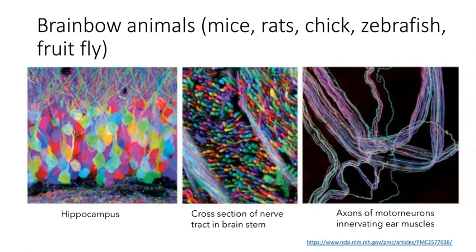The staining techniques I've shown you in this video have ranged from relatively simple to really quite complicated. There are many neuroscientists that go through their entire career and never look at tissue stained with anything more complex than a Nissl stain. But for other neuroscientists, those who are interested in studying the brain at the level of individual neurons and their interconnectedness, advances in cell and molecular biology have made possible experiments that Cajal and Nissl could only have dreamed of.